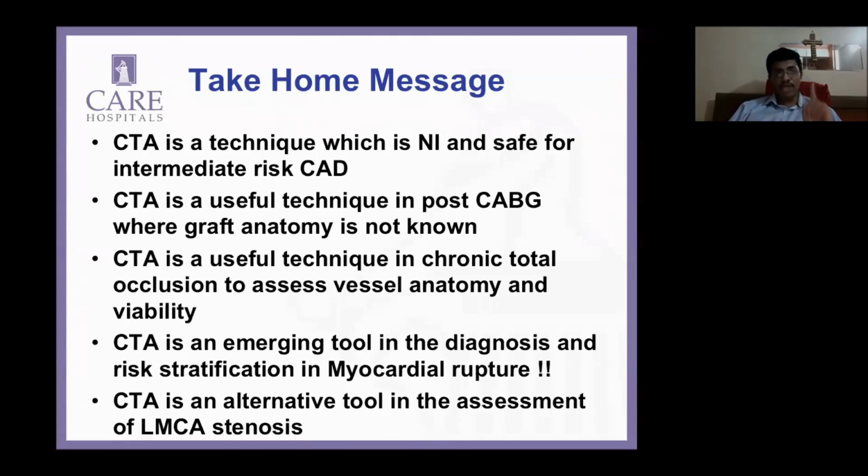Atherosclerotic plaques, these are non-calcified plaques, which would be invisible on a calcium score. And out of that 10%, about 20% of that 10% actually had interventions to go with it. So you're looking at not a large number, but a number of patients who with a 0 score actually went and had an intervention.